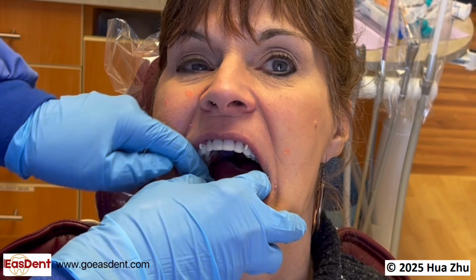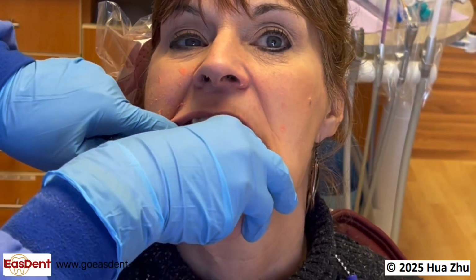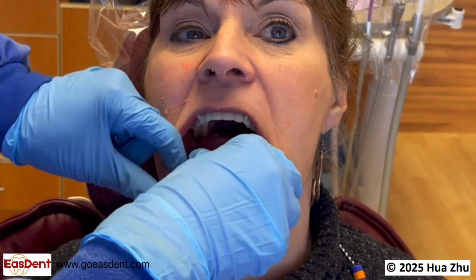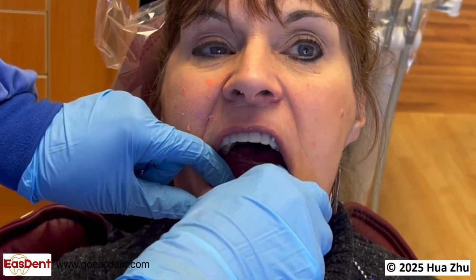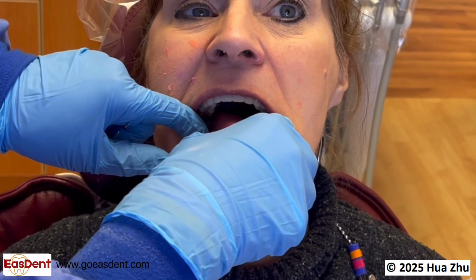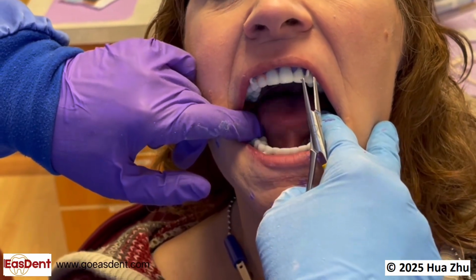Hold the mandibular tray in position. Use your fingers to press the material thin into the lingual vestibule, especially the distal lingual vestibule and the retromolar pad areas, in case there's some actual moldable material pushed out to the lingual border. Let the patient move the tongue around to mold the lingual border.